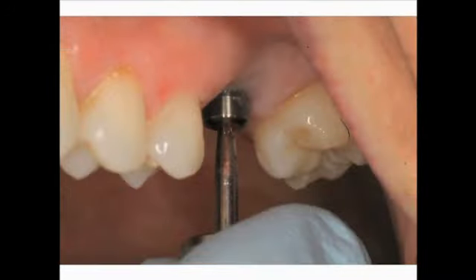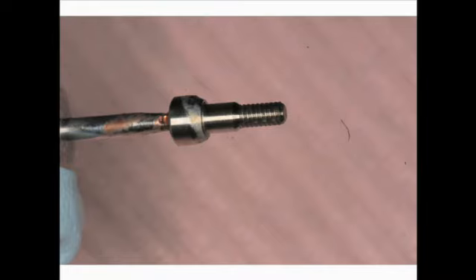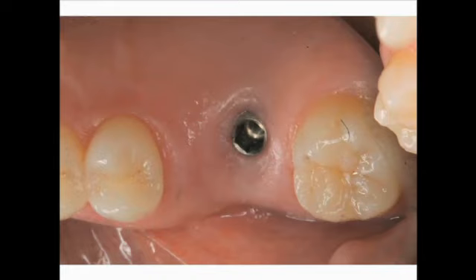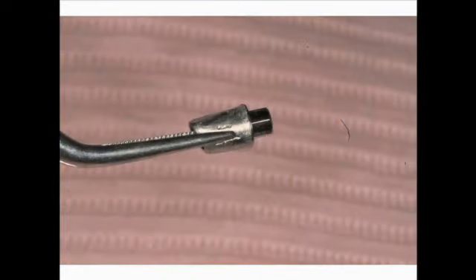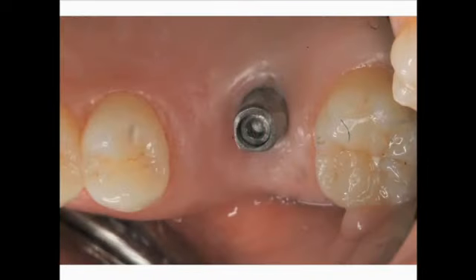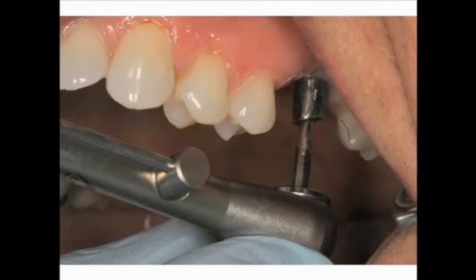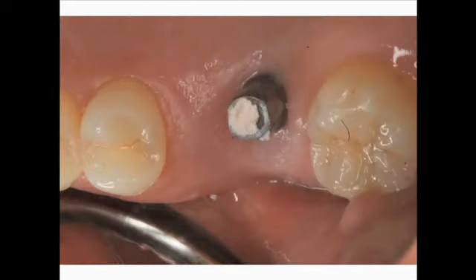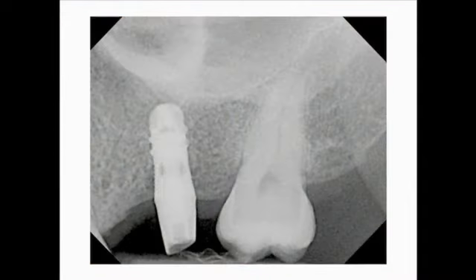The healing abutment is again removed from the mouth prior to prepared abutment seating. You can see a little bit of plaque around the healing abutment. Here's the body of the implant. Here, the abutment is taken to the mouth. A hex driver is used to engage the internal design of the implant, and the abutment is torqued to 25 Newton centimeters. The abutment screw opening is again covered with either silicone or cotton and Cavit prior to crown cementation. A radiograph of the abutment in the proper position.